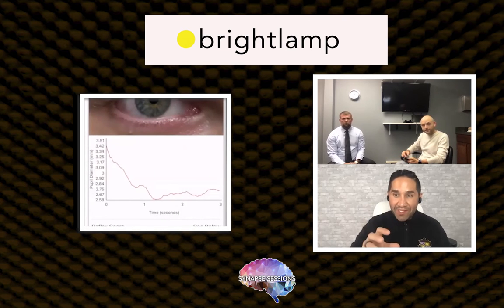Okay, so in that time that the camera was up to the eye, that's all you needed to grab that data? Yeah. Wow, that's fast. About how many seconds total do you think that was? From entering patient data to taking the test and processing results, it's about 30 seconds.